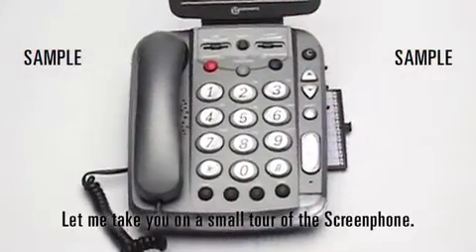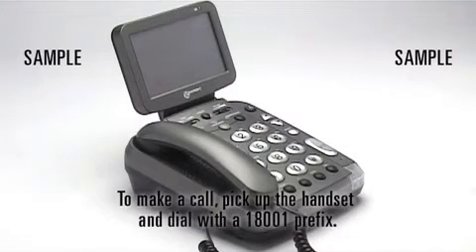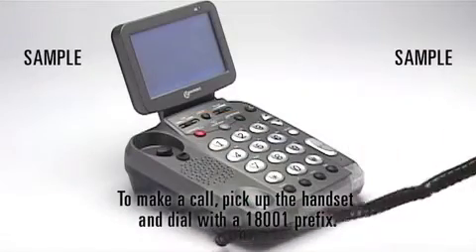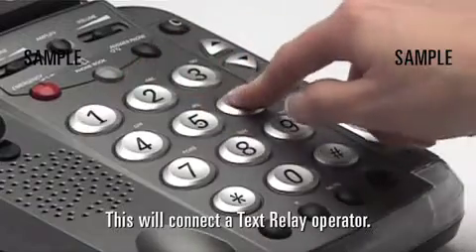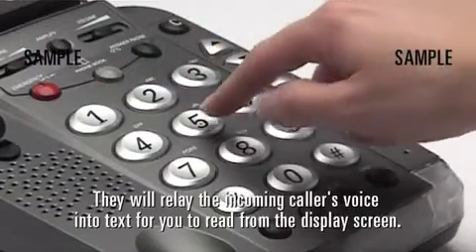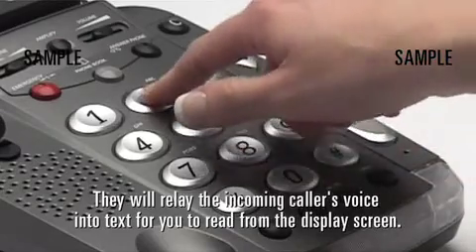Let me take you on a small tour of the ScreenPhone. Once your phone is plugged in, you're ready to enjoy communicating with your loved ones again. To make a call, pick up the handset and dial with an 18001 prefix. This will connect a text relay operator, who will relay the incoming caller's voice into text for you to read from the display screen.